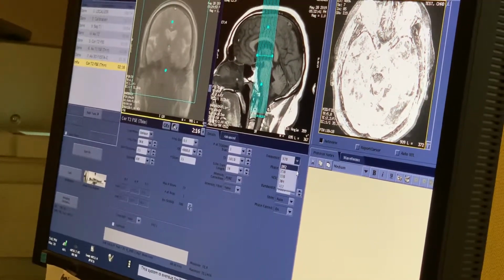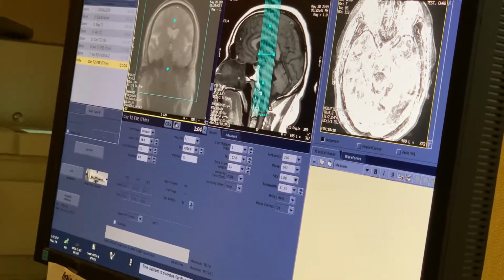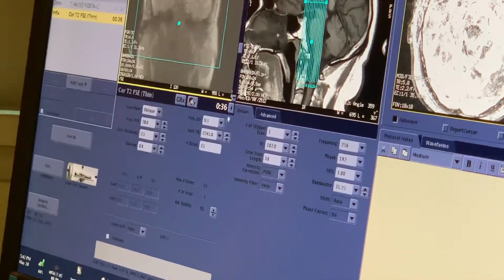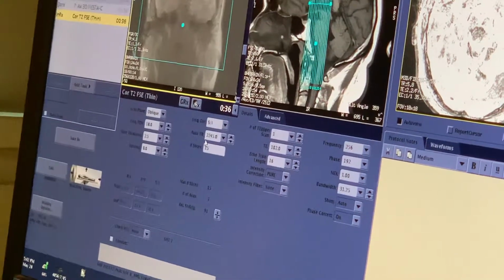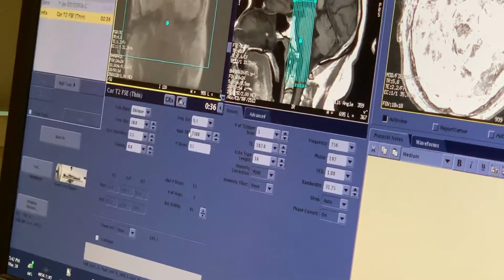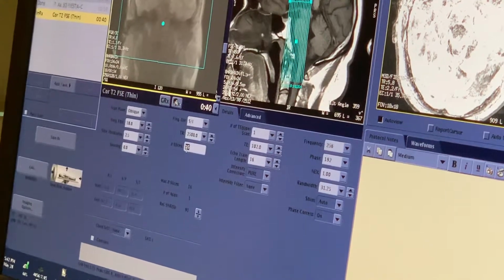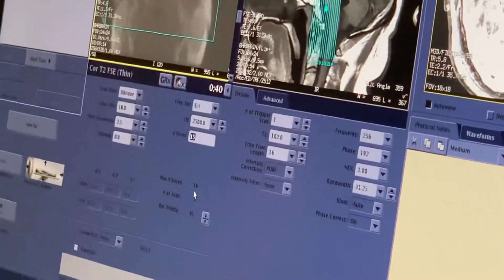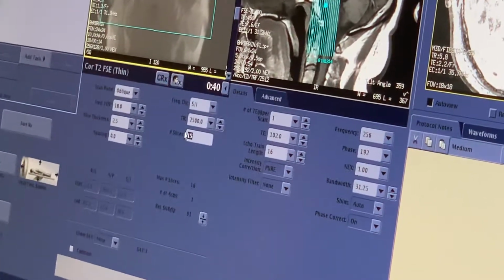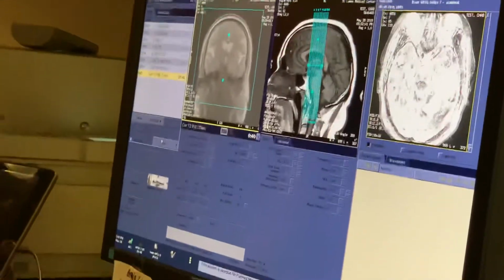So 256, 192, let's see the one next. All right, so for one acquisition, I have a TR that's too low for a T2, so this is another type in. I want you to put in 2500. That's the lowest TR that you're allowed. Now you're not completely optimized. You've got basically 16 seats for 15 riders on the bus, but you can't do anything about it without adjusting echo train length or doing something else, which we're not going to do. You save that. It's okay.